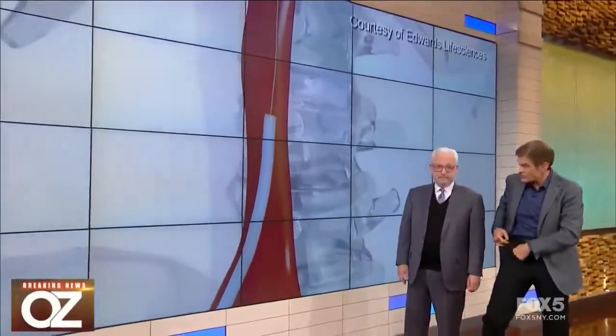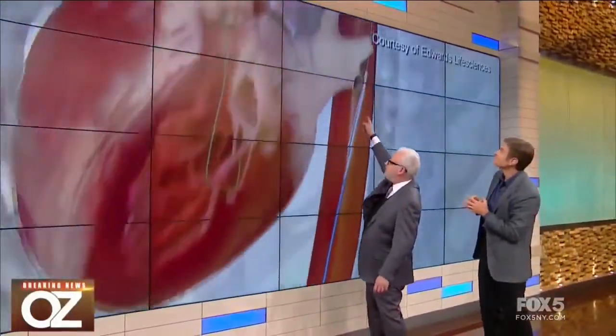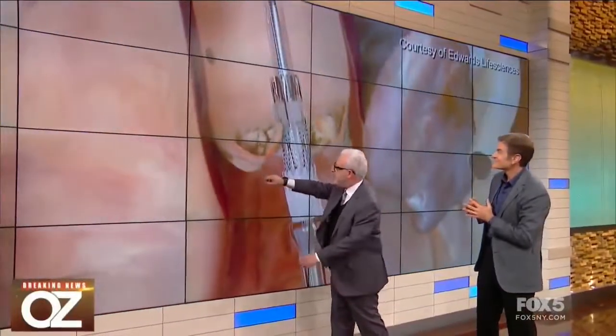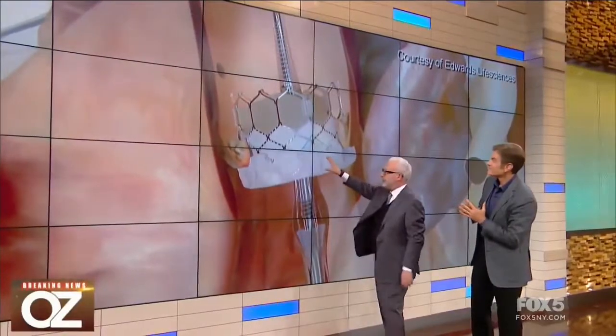Martin actually helped lead the development of the device and the TAVR trial with Michael Mack and some great engineers, both named Stan, by the way, the Stans. So show everyone how this works and how much effort it took to make this happen. So you basically make a little cut in the groin, and there's the catheter. The catheter goes up, we snake the catheter across the aorta, then we cross the old valve here, the diseased valve, and then we expand the new valve. And you can see the new valve is expanded, and now it works like a normal valve.